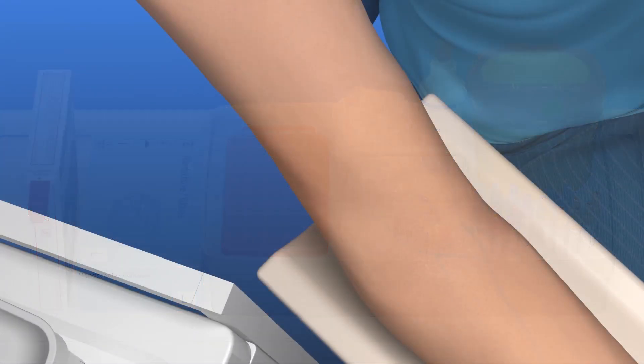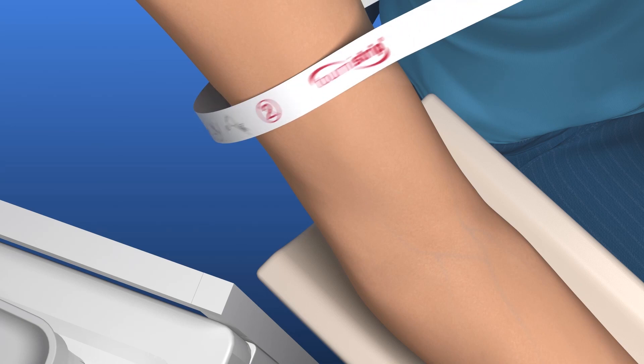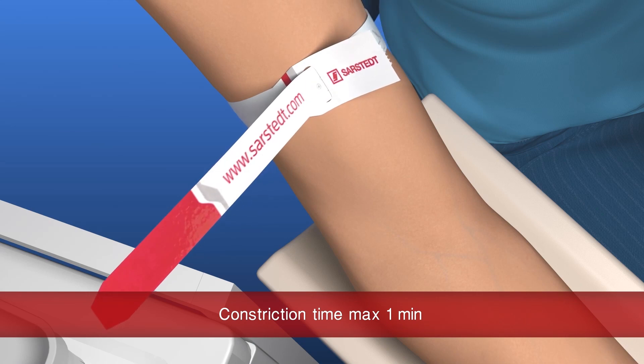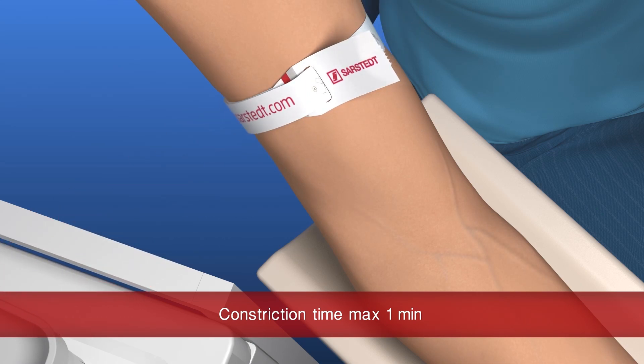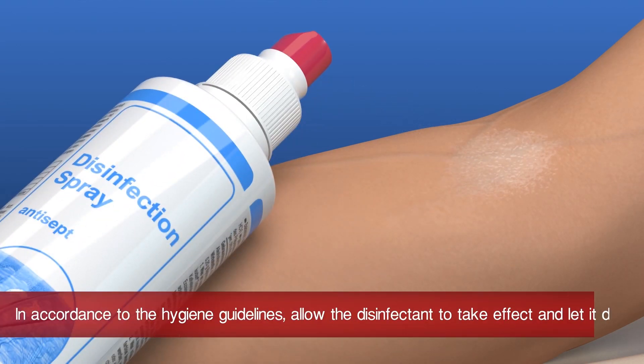Now apply the tourniquet. For optimal sample quality, the tourniquet should be left on for a maximum of one minute. Examine the veins and select a suitable vein. Disinfect the skin around the chosen puncture site.